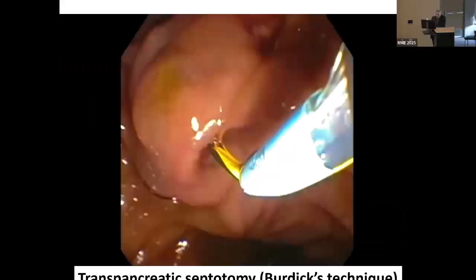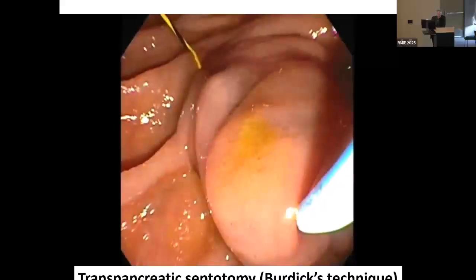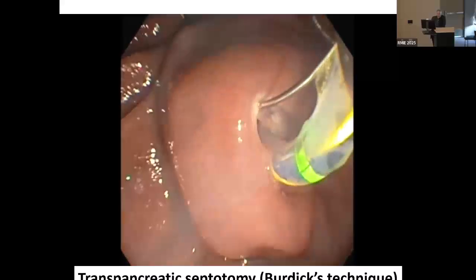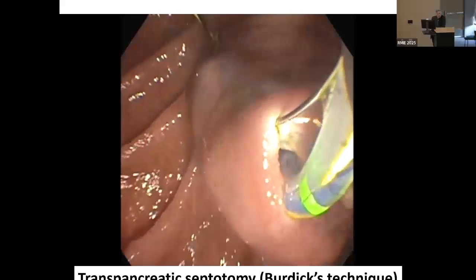I actually mentioned this to whoever was at one of the groups in cholangioscopy. This is a trick, something that's very useful to know. Have a look at the upper left corner of this. You've been trying, and oh, okay, you couldn't get in. It happens not infrequently, and do not panic. That's actually good, because you then have an outbound and a direction in which you can start doing that.